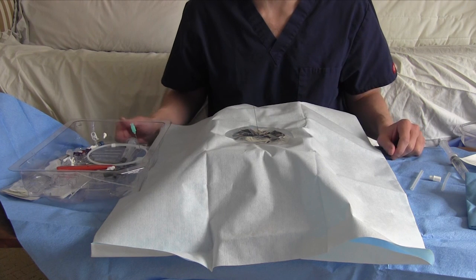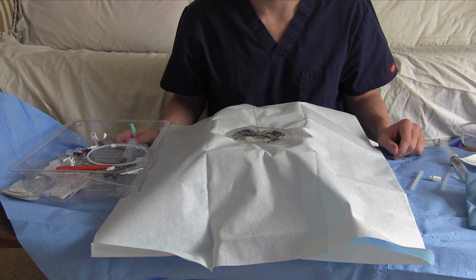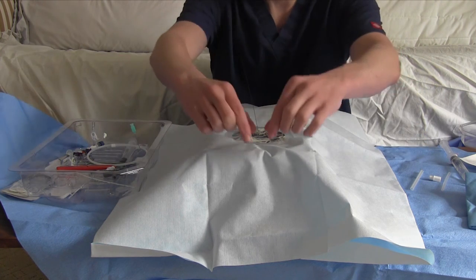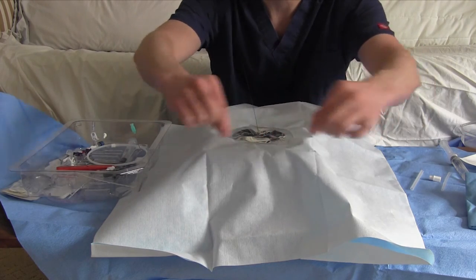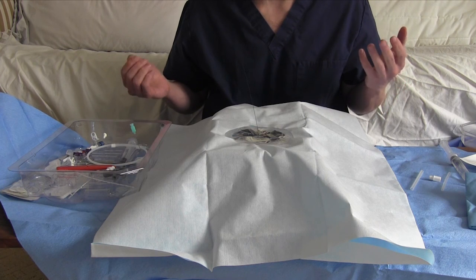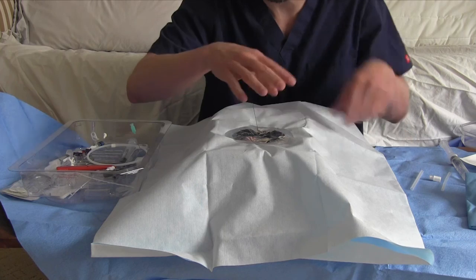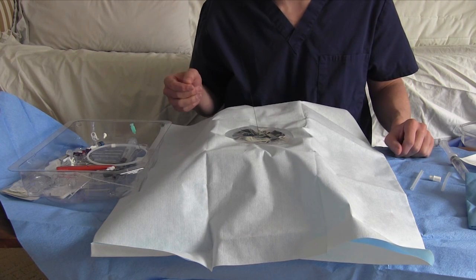And what we've been doing is just asking an assistant in the room to slip under the drape and pop the tourniquet. But you're not going to be able to do the rest of this with the tourniquet on, and yet it's not easy because it's underneath the drapes. And when doing it alone, we have been reaching under the drape itself and pulling the tourniquet, which is doable, but you've got to find both ends. It's kind of annoying. I've seen the PICC nurses at other hospitals have tourniquets where you just push a button and it pops open, and that's obviously the easier way to go. For now, this is a problem still looking for a solution.